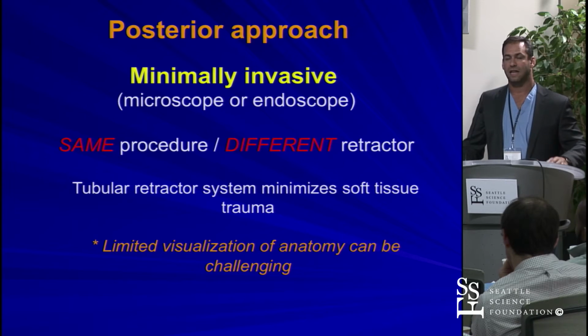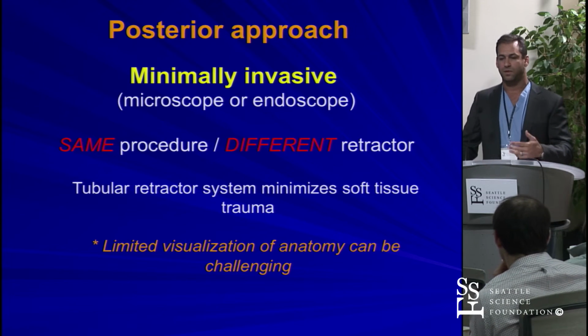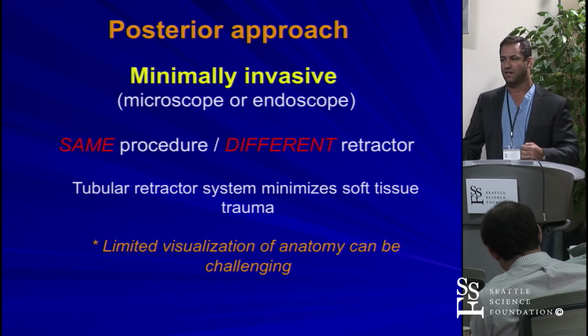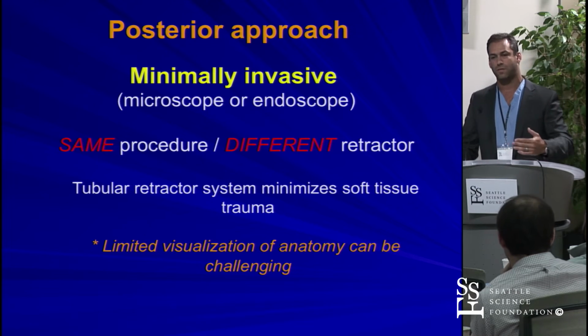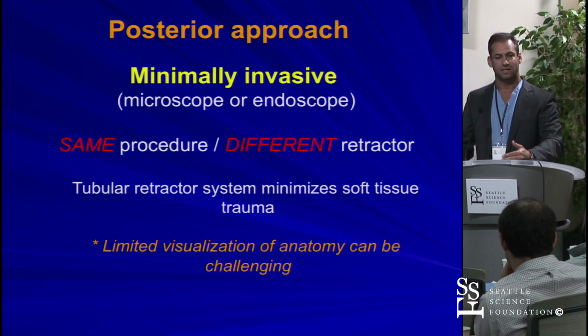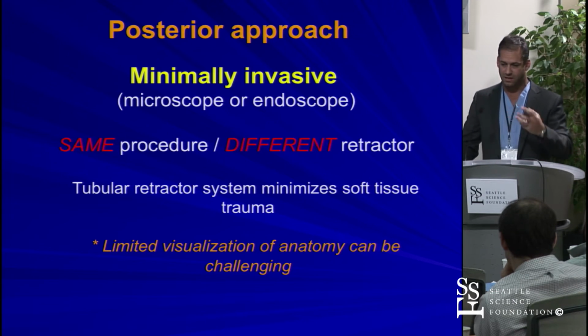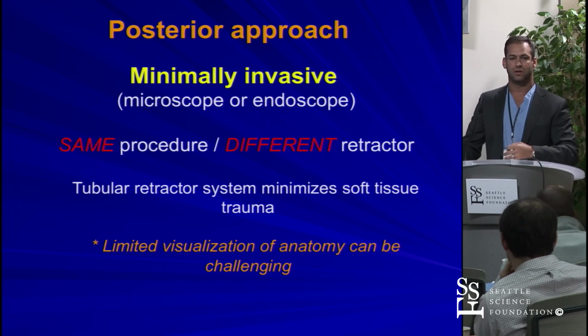So, minimally invasive, and this is kind of why I was recruited, and why oftentimes a lot of these patients end up in my lap, is because they like the idea of minimally invasive surgery. Now, minimally invasive can mean a variety of things. What I often try to tell people is that minimally invasive does not mean you're getting a different surgery. What it does mean is that I'm going to get to the problem differently. But once I get to where the problem is, the surgery is the same. It's not a shortcut. It's not a back door. It's simply less intrusion or less invasion to the surrounding natural structures.